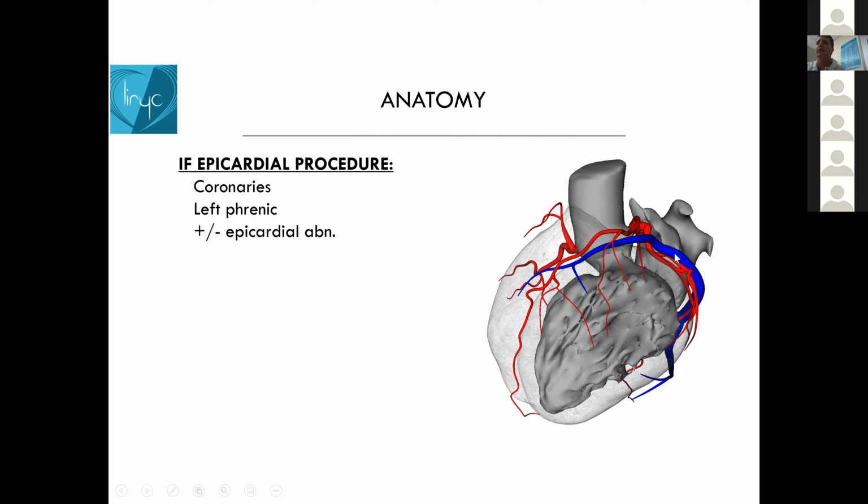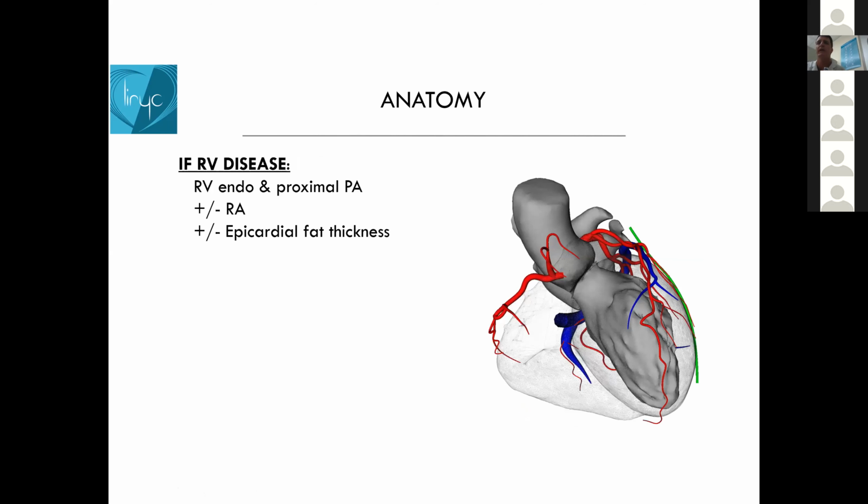And so here's your great cardiac vein extending out to the anterior interventricular vein, and a catheter there can certainly help guide our registration and avoid injuring large diagonal vessels or obtuse marginal vessels in particular, or the phrenic nerve you see there.